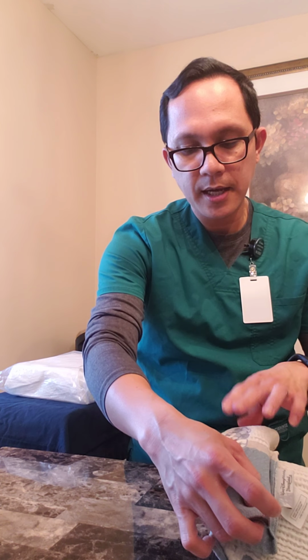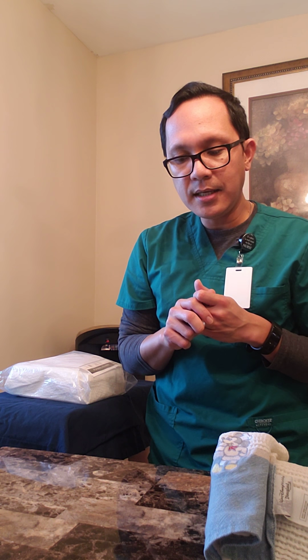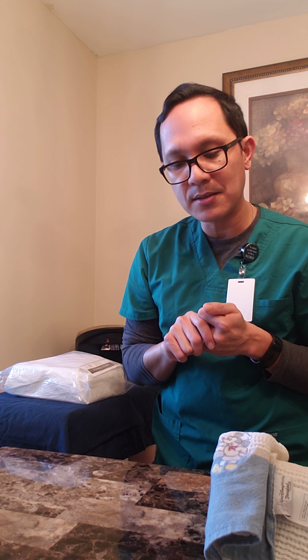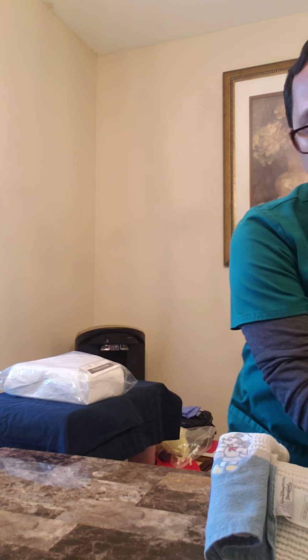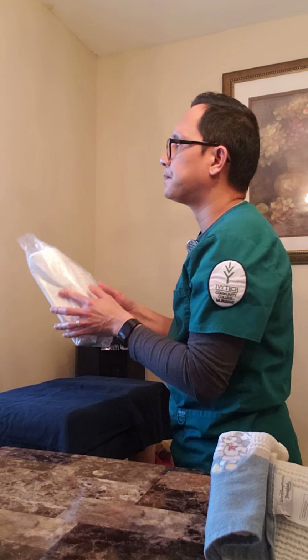Then I'm just going to expose your perineal area, okay? If you can just open your legs for me, flex your knees and put both of your feet on the side, and just drop your knees so it makes it open. In that way, it is safer for us to put the Foley in there, and it's also going to be easier to get in there. It won't take us a long time, okay? All right, thank you very much, Mrs. Smith. At this point in time, I'm going to do hand hygiene one more time, and I think I'm ready to open the package.